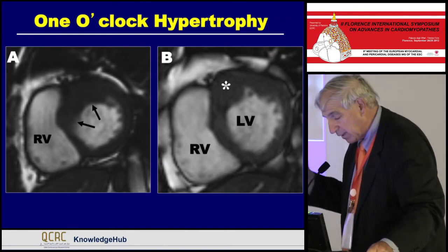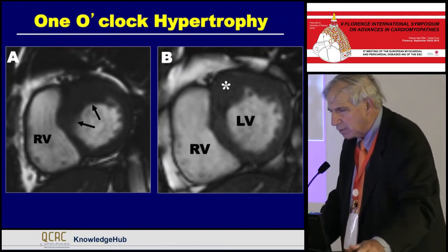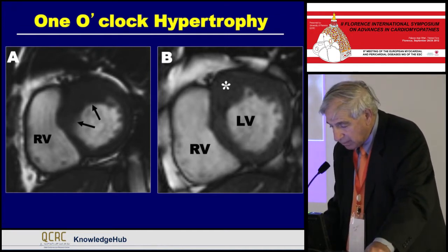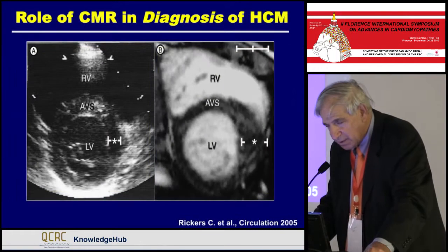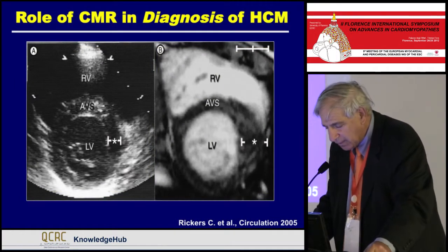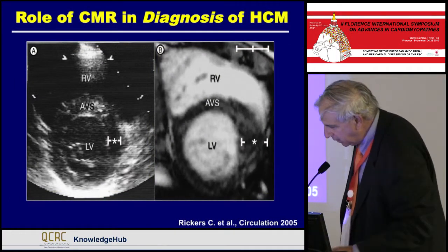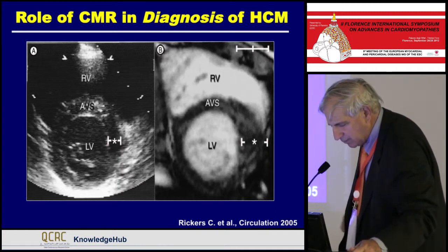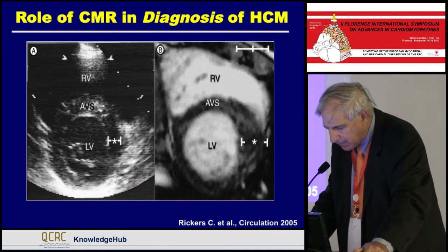That's where it's really thickest. So all these years we were looking at what we thought was the thickest at 12 o'clock, but it is really somewhat thicker in the patient population, removed, and in an area that the echocardiogram didn't really provide precise measurements very often.